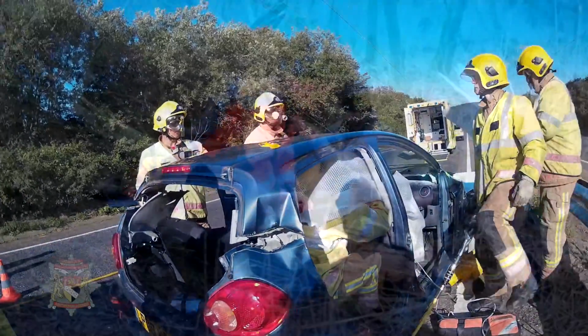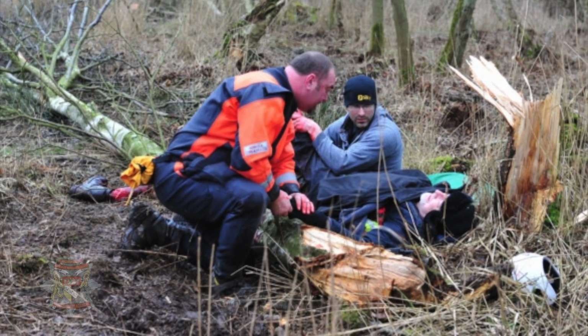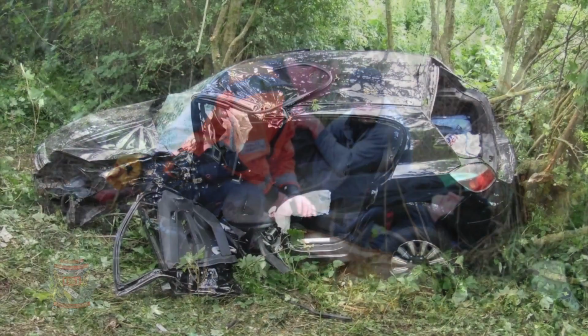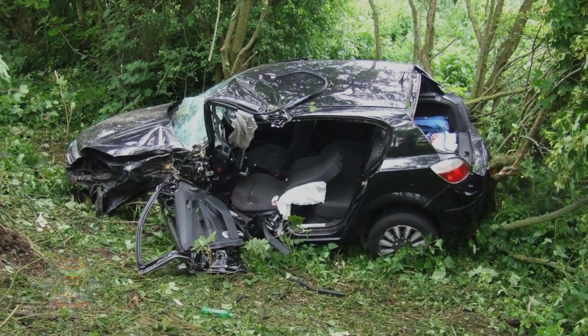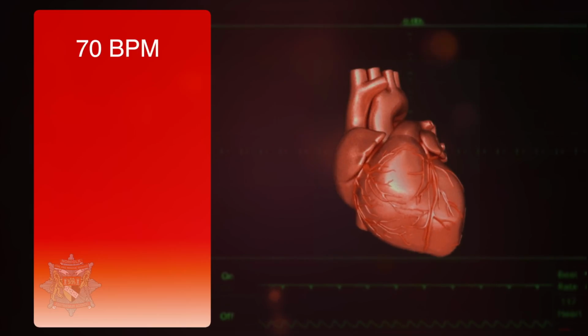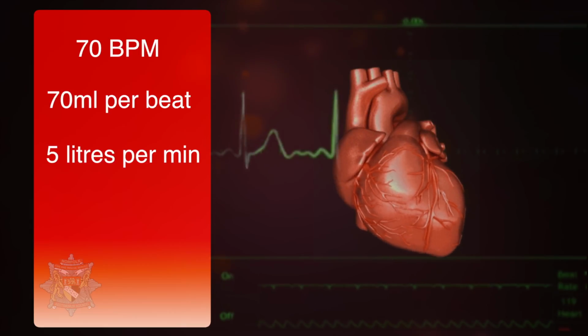Blood loss caused by major trauma such as full or partial amputation of a limb or extremity, or arterial laceration can very quickly prove fatal. The average adult resting heart rate is around 70 beats per minute. Each beat of the heart is capable of ejecting 70 milliliters of blood, which equates to almost 5 liters of blood every minute.